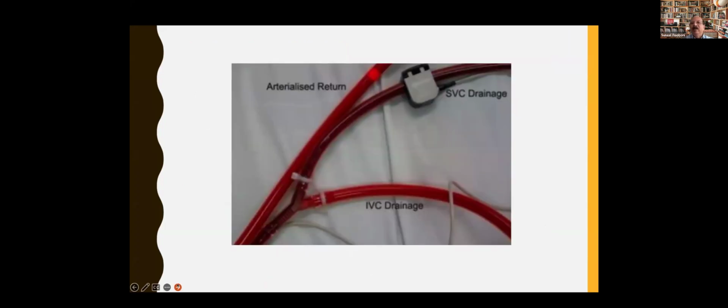So when recirculation starts, one of the very important tasks for us is to recognize it: you will lose the identification of the two different colors. Here you can see the dark blood or the deoxygenated blood as dark in color and the oxygenated blood as red in color.